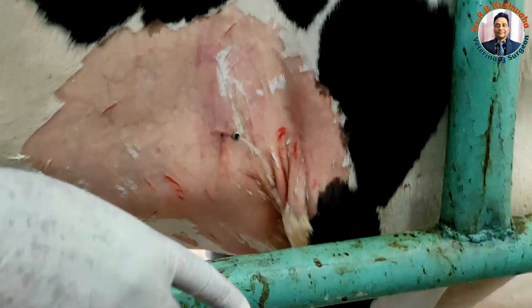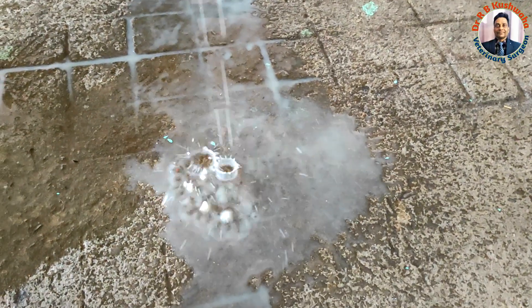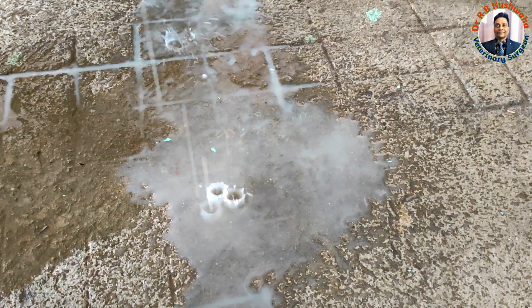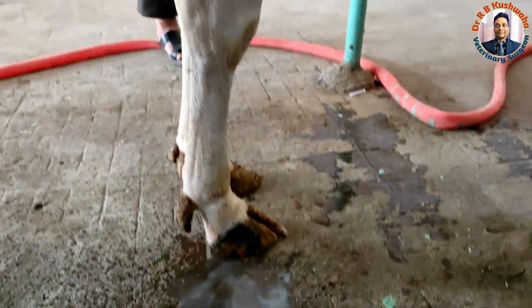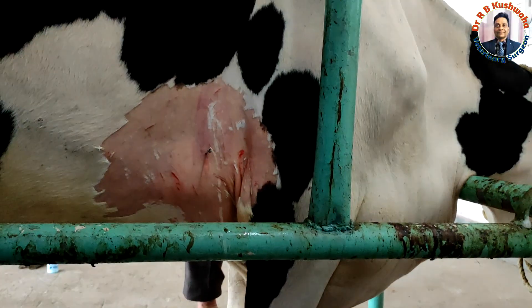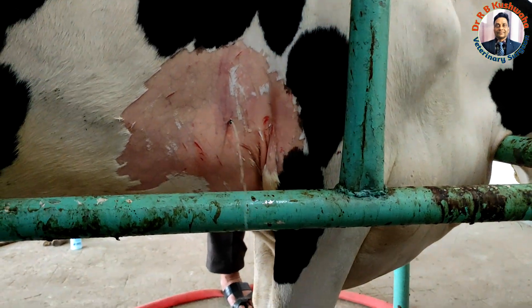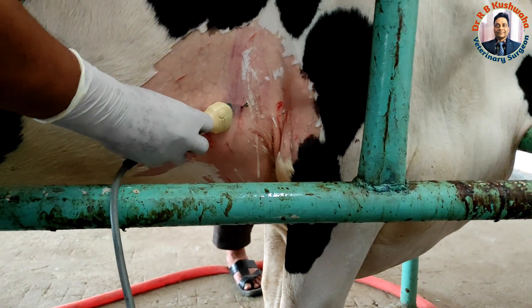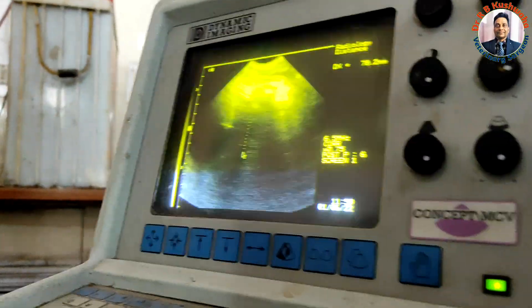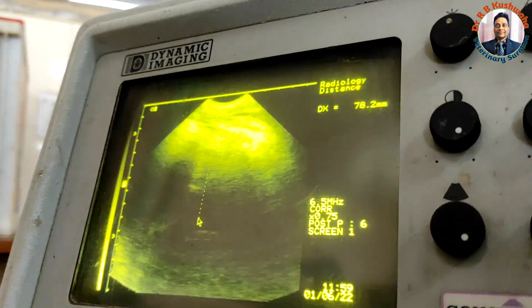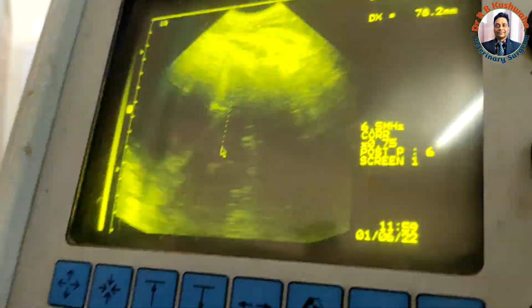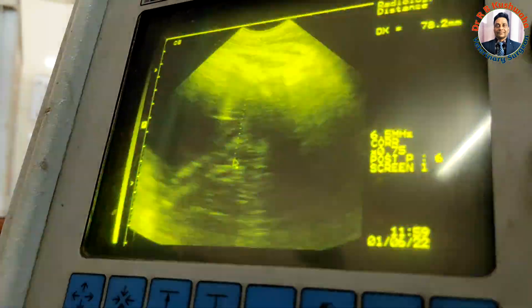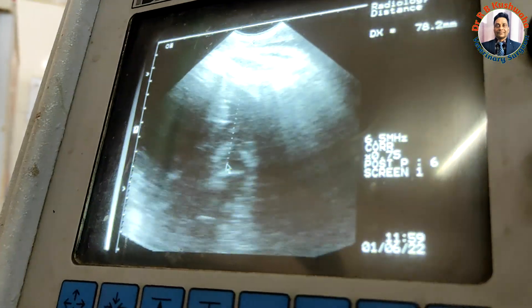You could see the color of the fluid — it is white and flat. There is also a pretty foul smell coming. Now I show this with the needle here. The needle is seen as a hyperechoic line on the ultrasound.